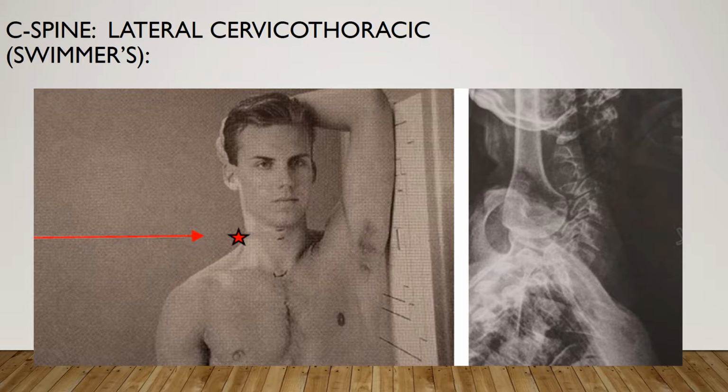You want to elevate the arm and shoulder closest to the IR and rotate the shoulder slightly anteriorly or posteriorly. The opposite arm is down. You want to relax and depress the shoulder with slight opposite rotation from the other shoulder to separate the humeral heads from the vertebrae. This may also be taken in lateral recumbent position with one arm and shoulder down and one arm or shoulder up.